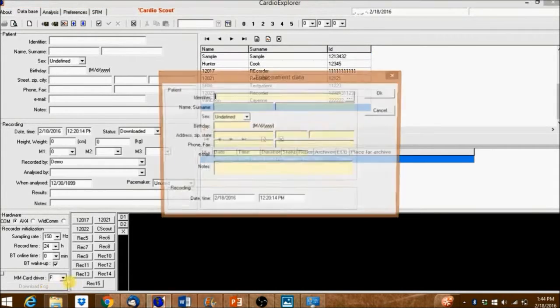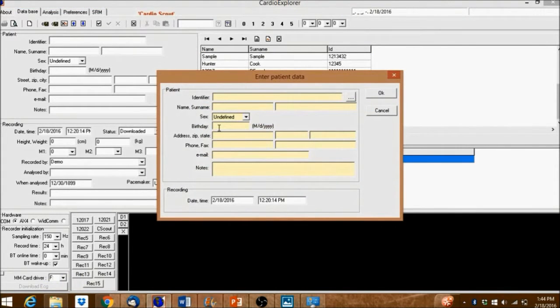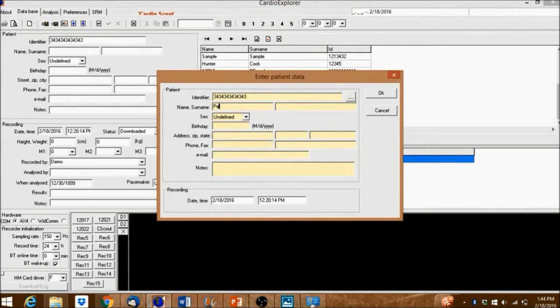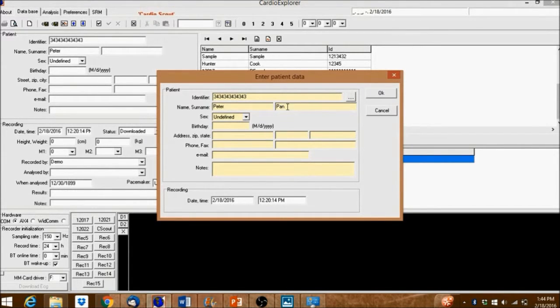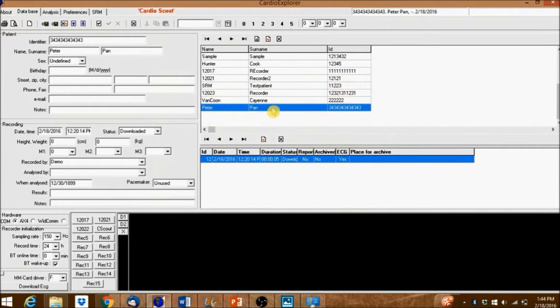If this window appears, it means that the recording has not yet been assigned to a patient. Fill out the patient information and then click OK. Notice how the patient information was transferred to the recording.